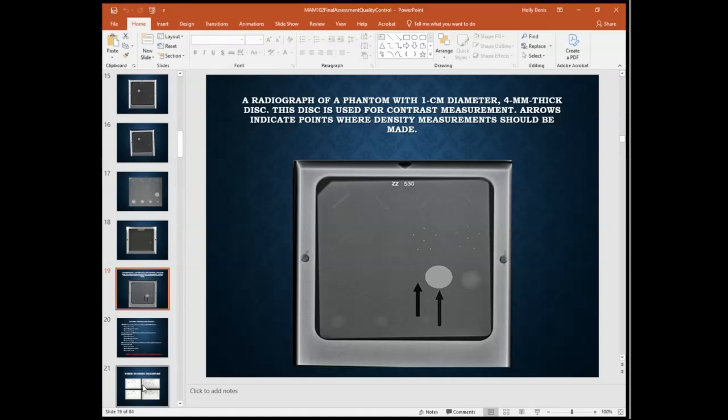So anyways, on this one, I can see a lot of fibers though. So I can see fibers 1, 2, 3, 4, 5, and I think I can see more than a half. I can see about 3/4, so I would count that as a full point. So I would count that as 6.